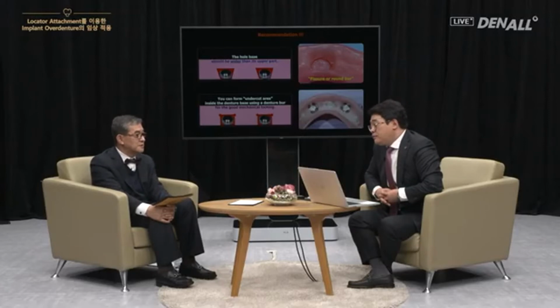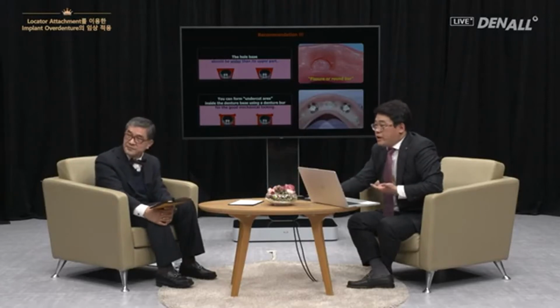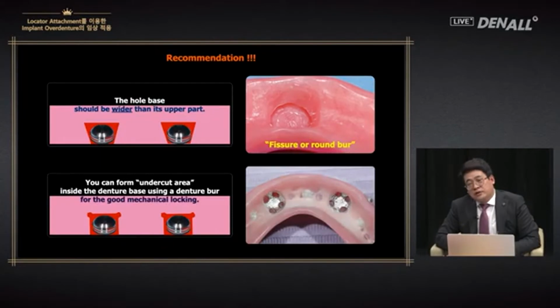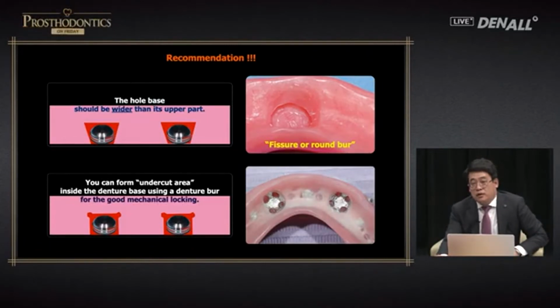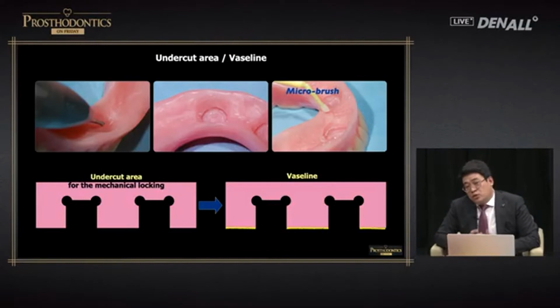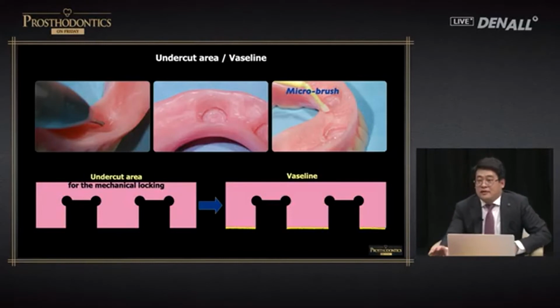As I mentioned earlier, when you design the metal framework, if the metal framework covers the processing cap, then you cannot get the chemical binding, and it is very difficult to adjust the metal framework. Therefore, you should do it in a crisscross way and create undercut. And once attached, it doesn't fall out. And since then, I was able to avoid such problems.